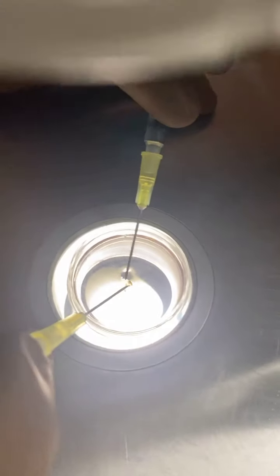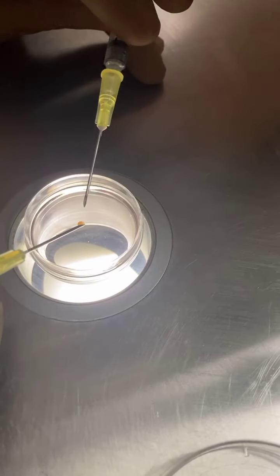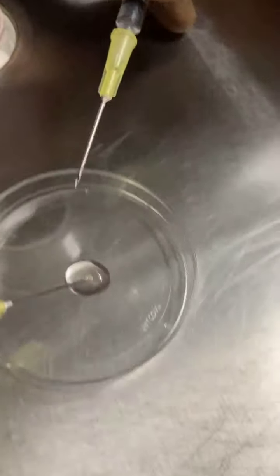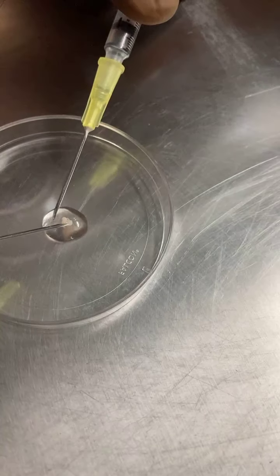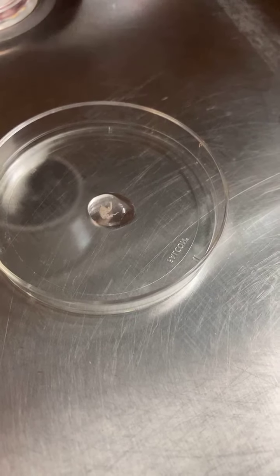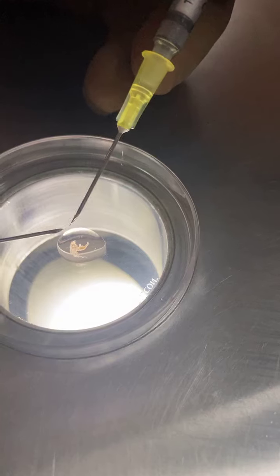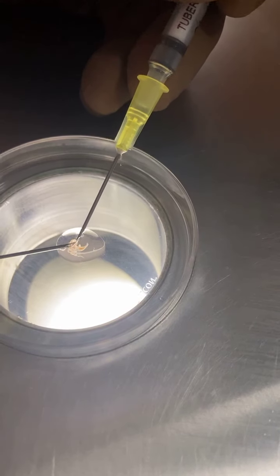Under the microscopic vision, I'm going to lift up the seminiferous tubule — just lift up. See, the whole thing got lifted, and I'm going to put it inside this droplet which I have just prepared. At the same time, a glass slide is going to be kept ready. See, this goes inside.